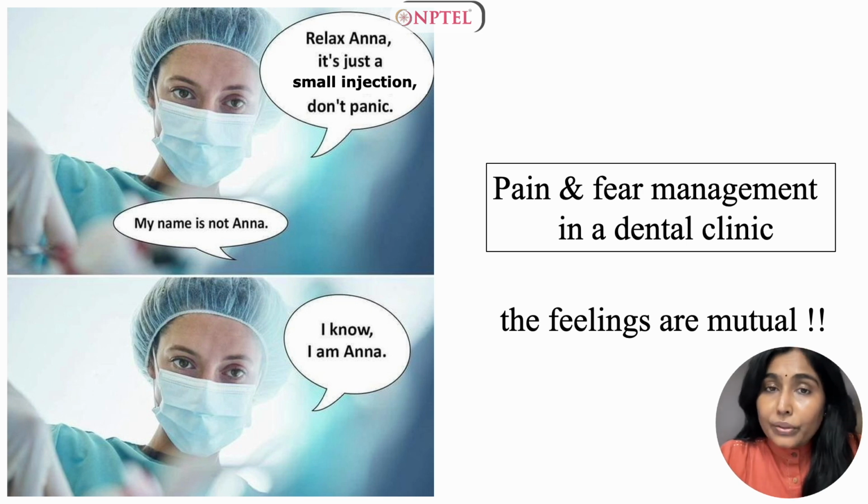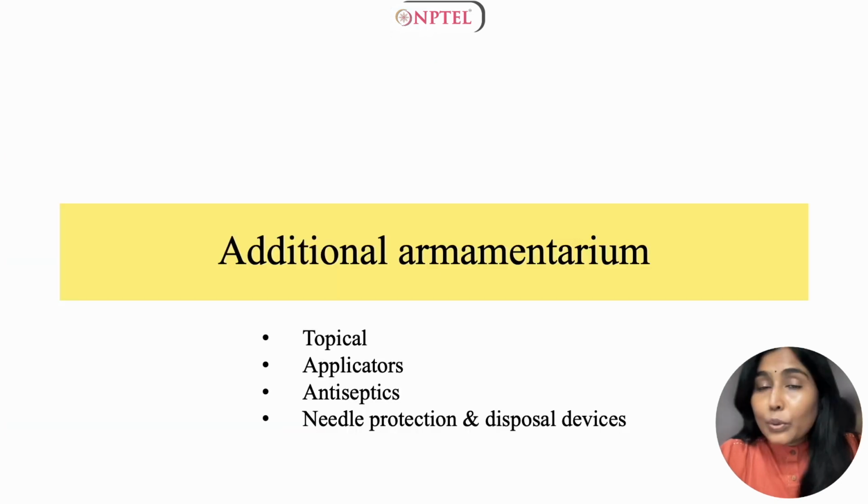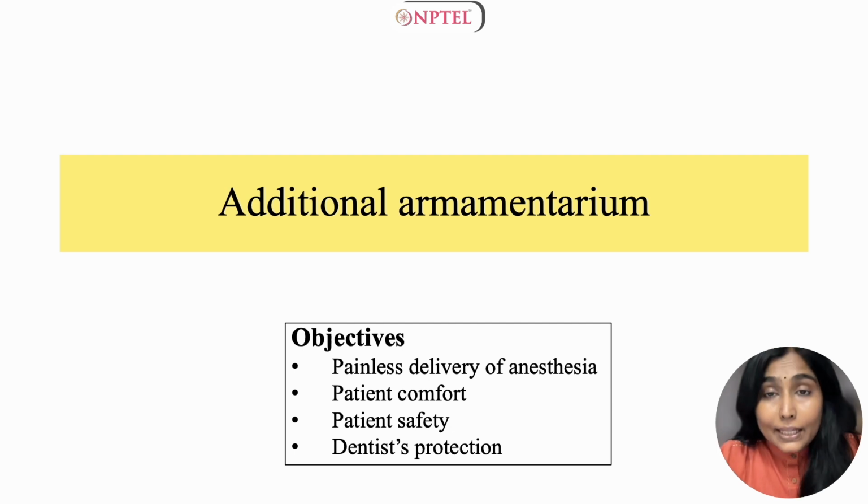So, this lecture aims at all the pre-anesthetic preparation or conditioning of oral tissues as well as the patient to ensure effective anesthesia and patient comfort. The support system includes various materials and instruments which are used to prepare the patient or the tissues, aligning with our objectives of painless delivery of anesthesia, patient comfort, patient safety, and dentist protection.